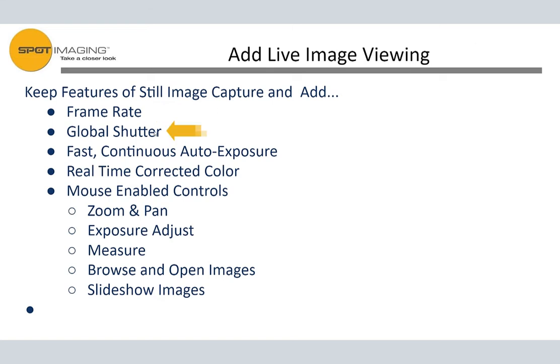The next thing is global shutter. The IDEA cameras are a lower cost camera and sensor, and they use something called a rolling shutter. And if you start looking at whenever you move the slide, it looks like the sample gets all wavy or wiggly, looks like it's doing a hula dance sometimes. It's another thing that annoys a lot of people for live mode, is that if they're doing a lot of presentations to a big group, they don't want their images to be kind of wavy. So you'd like to get the global shutter, and so we like to select for that on our live imaging cameras.